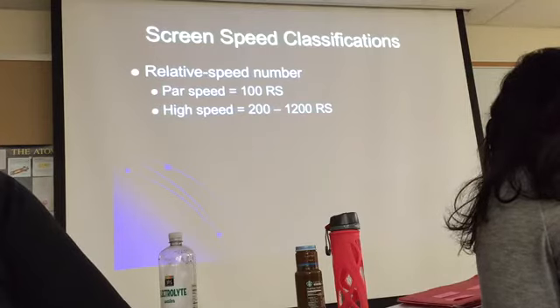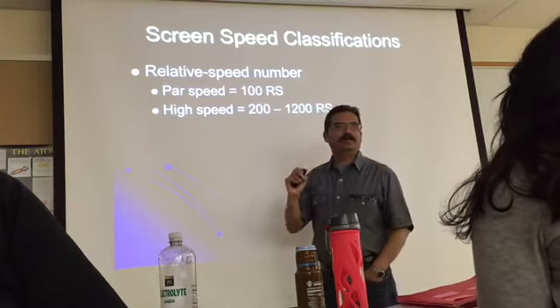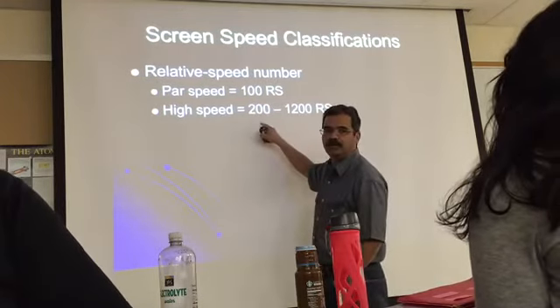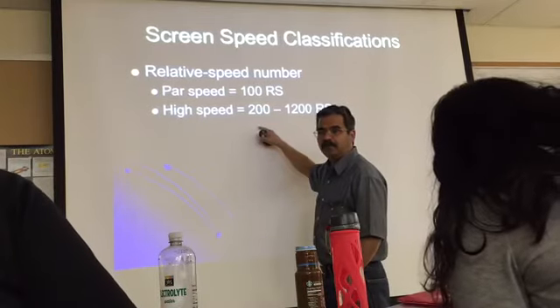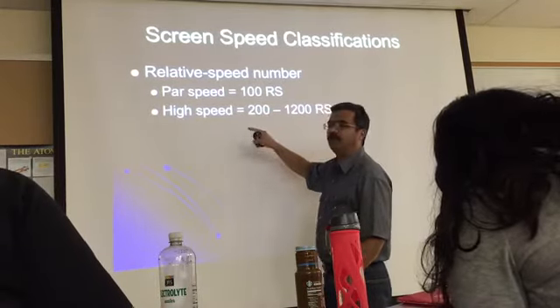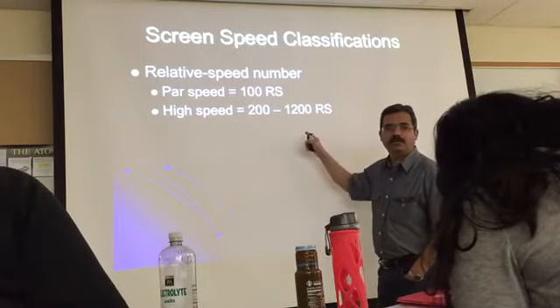Okay. What most hospitals did, you can make a note there below here. What most hospitals did is they used the 200 speed screens for extremities to give you better detail. And then for everything else, for regular work, they used the 400 speed.